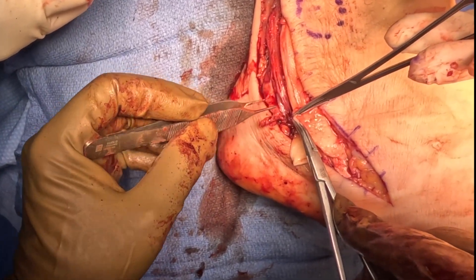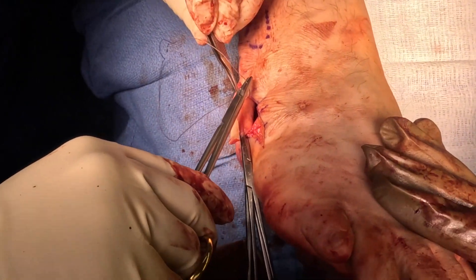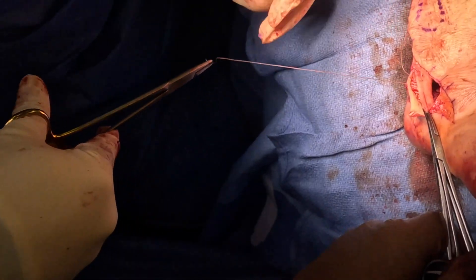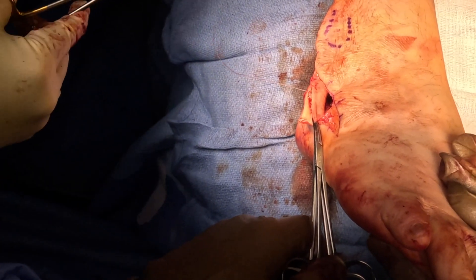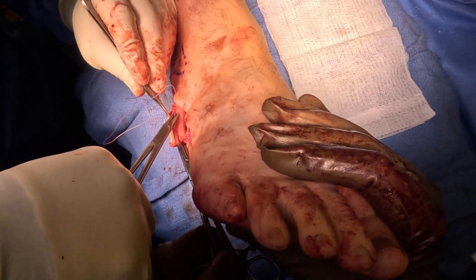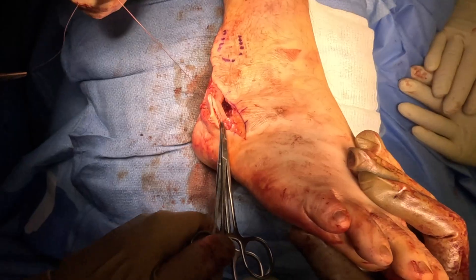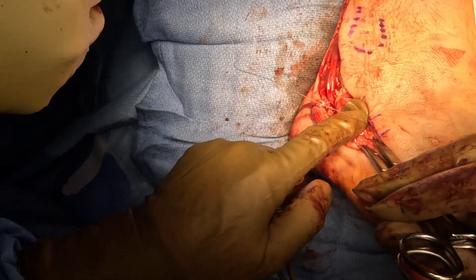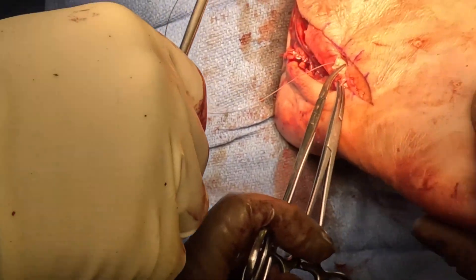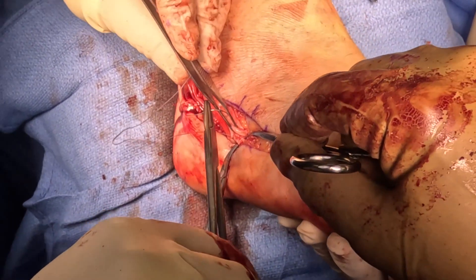The next step is wrapping a graft around those tendons. This is called an arthroflex graft — it's actually dermal tissue from the lumbar area of a patient's back. This is a donor graft that is harvested, fresh frozen, and prepared; we order them ahead of time and wrap them around the tendon. What's fascinating about these arthroflex grafts is that they incorporate into the body and become very strong tissue. I've had the opportunity to go inside a patient who subsequently developed an unrelated infection in an Achilles tendon after a similar repair, and we were able to see that graft — it was extremely strong, hard to dissect away from the tendons. It's remarkable to see how well these grafts incorporate.